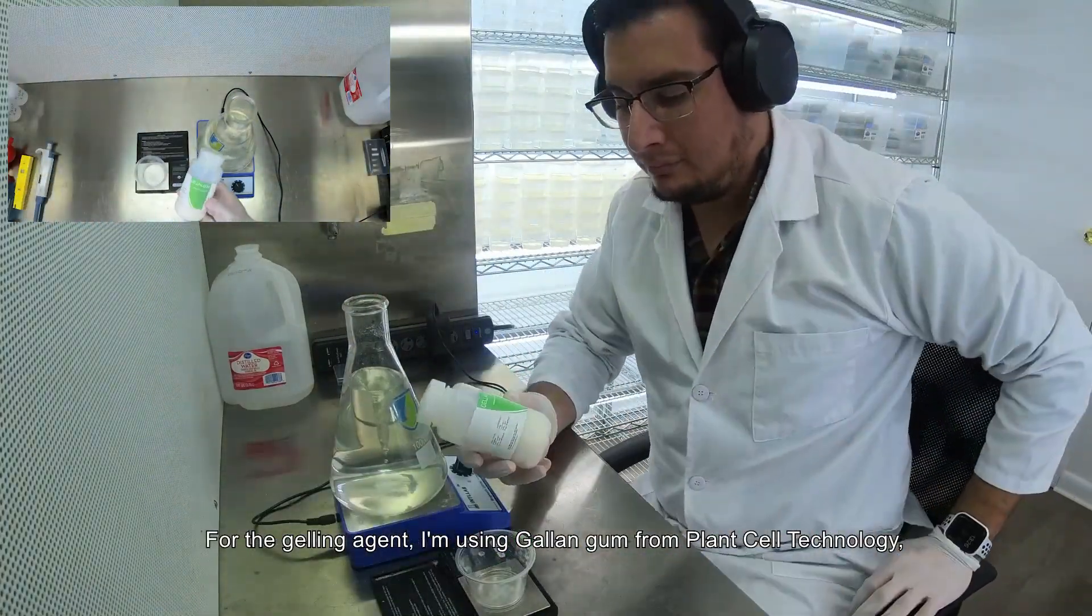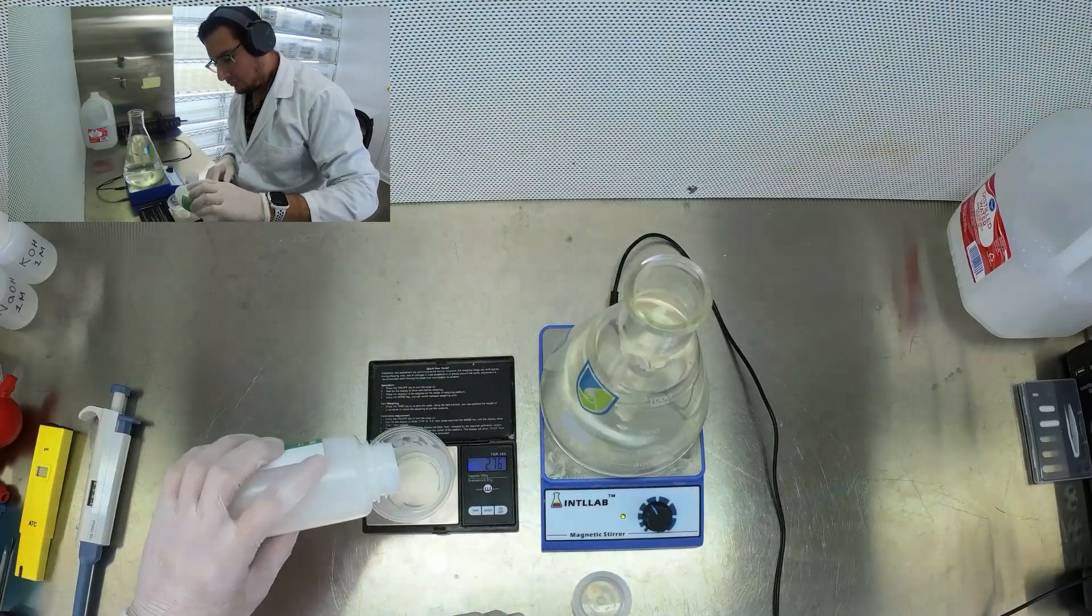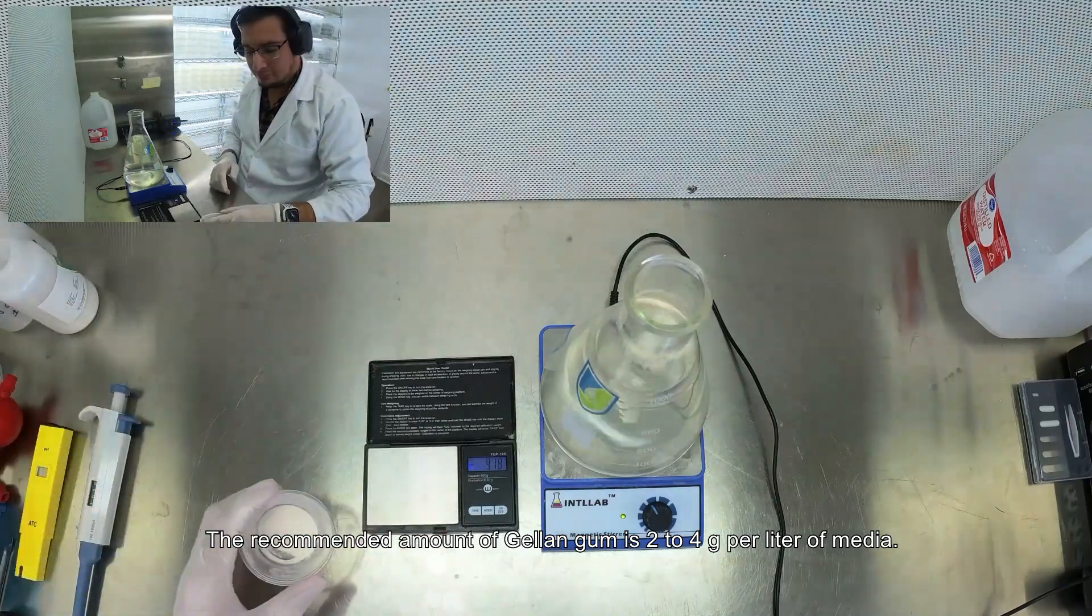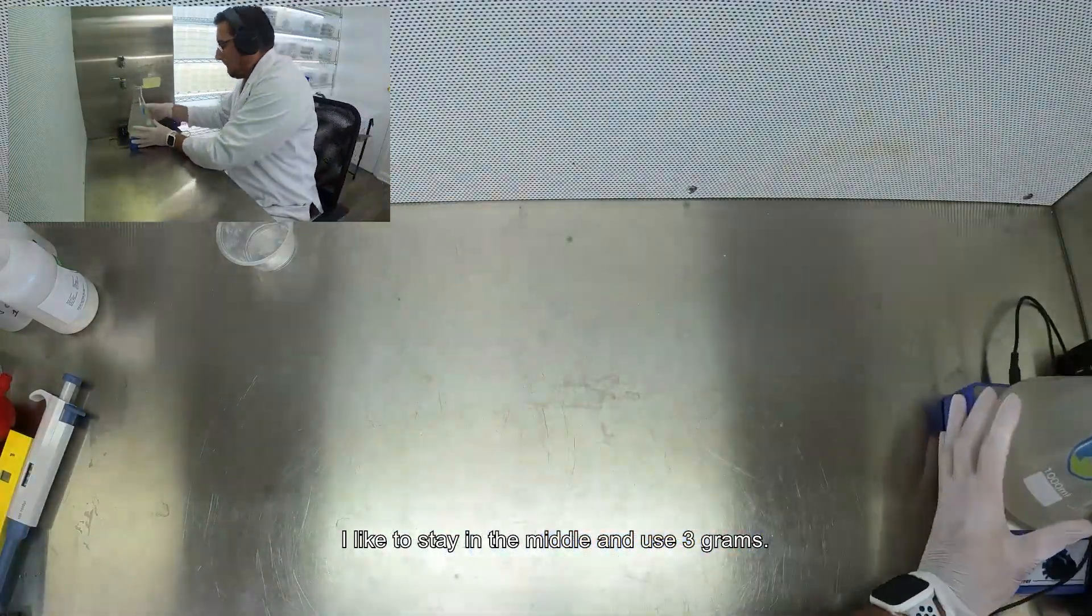For the gelling agent, I'm using Gellan gum from Plant Cell Technology, but this method also works for agar or Gelzan. The recommended amount of Gellan gum is 2 to 4 grams per liter of media. I like to stay in the middle and use 3 grams.